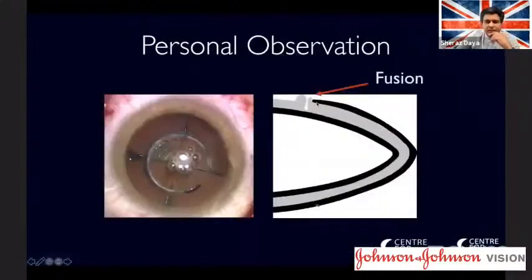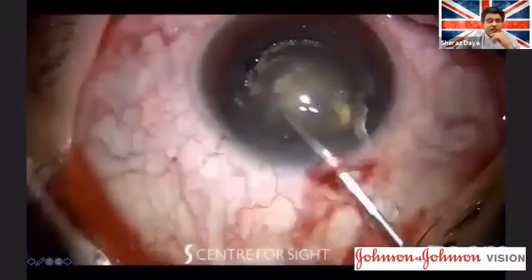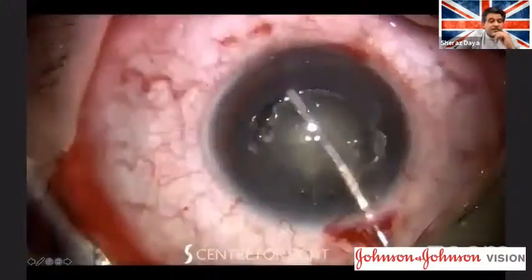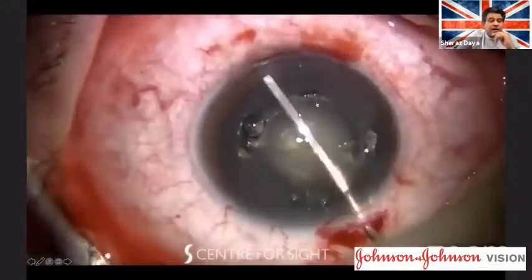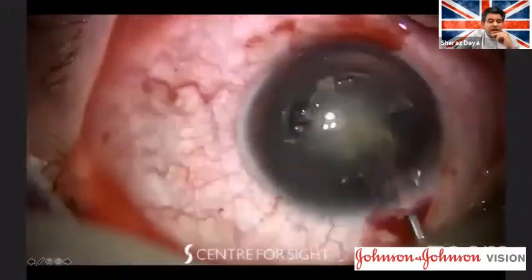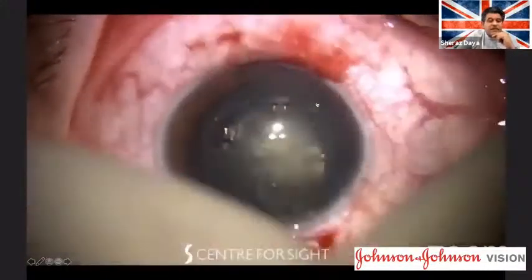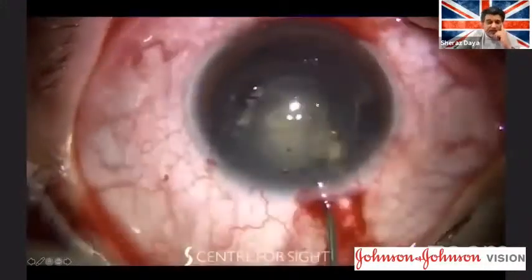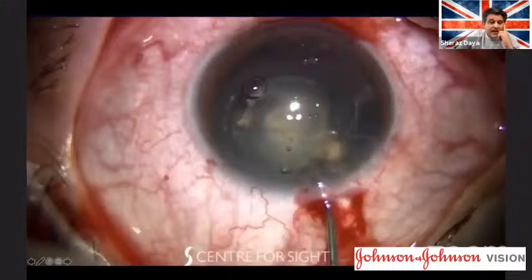When I did this myself, this is one of my first cases. Here I'm doing the conventional hydrodissection. You'll see the anterior capsule widening. That was kind of scary, and everything was quite stiff and solid. I had to rock the lens to release the fluid there. I decided I wasn't going to do that anymore. And so what I used to do was try and break up the lens.